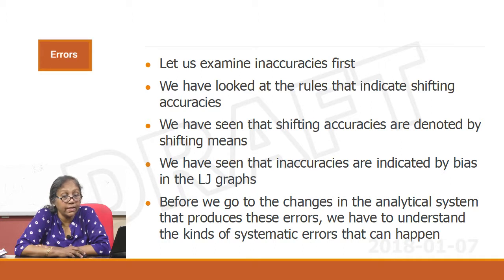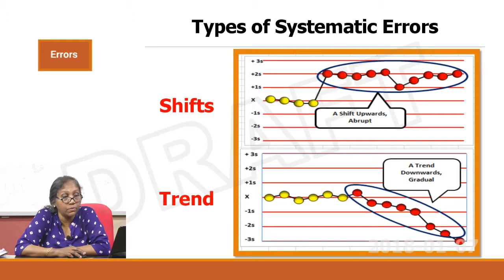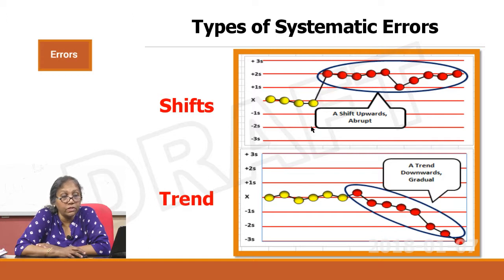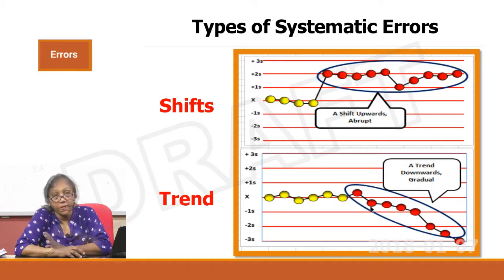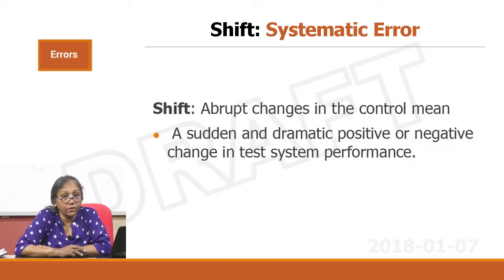Before examining changes in the analytical system that produce these errors, we need to understand the kinds of systematic errors that can happen. There are two types: shift and trend. A shift is a sudden, abrupt change in your mean — the mean was stable and suddenly shifts up or down. A trend is a gradual upward or downward drift, and the 7T rule is one that will pick up a trend.